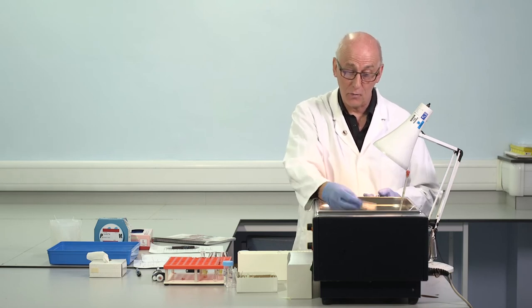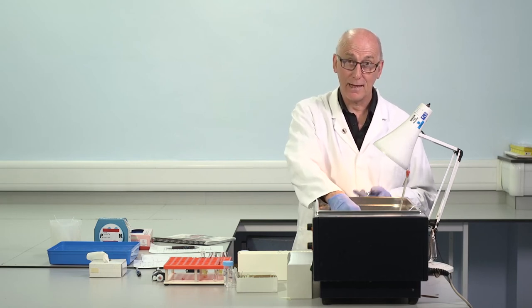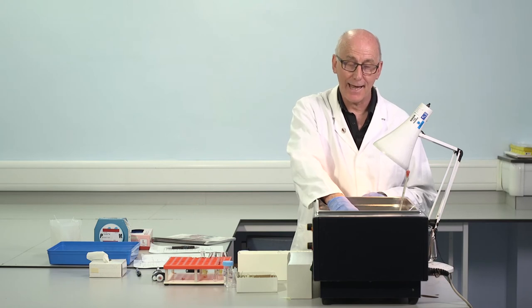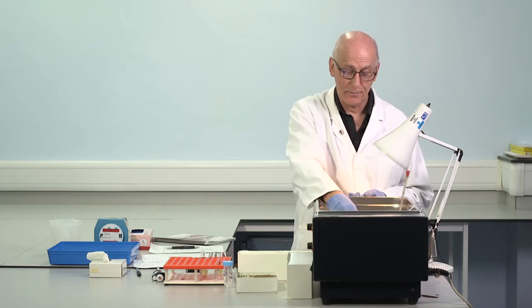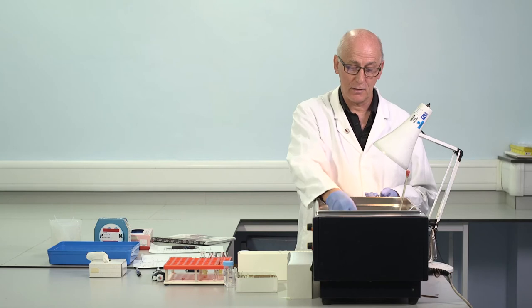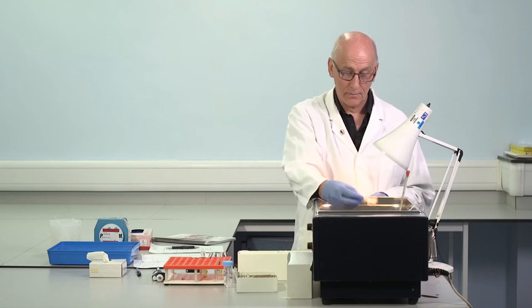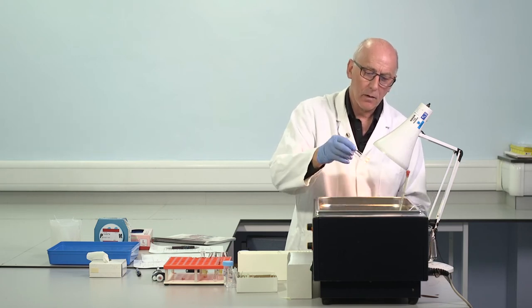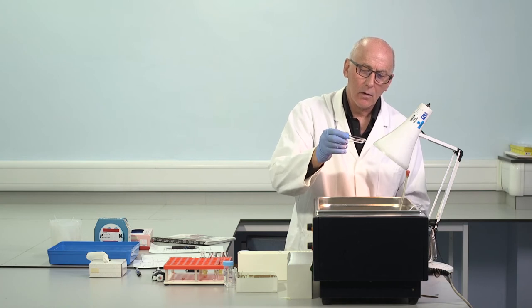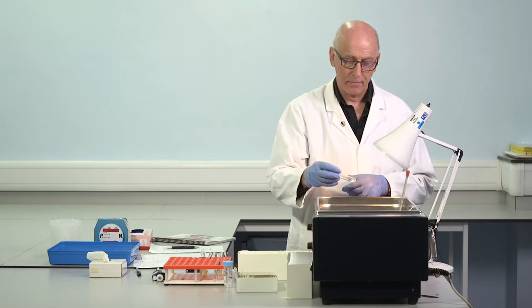Often an antibody, not always. Other types of inhibitor, direct acting anticoagulants, heparin, present in the test sample, still present in the mixture, will prolong the APTT in that mixture. So we can start to draw some clues about what the nature of the defect might be.